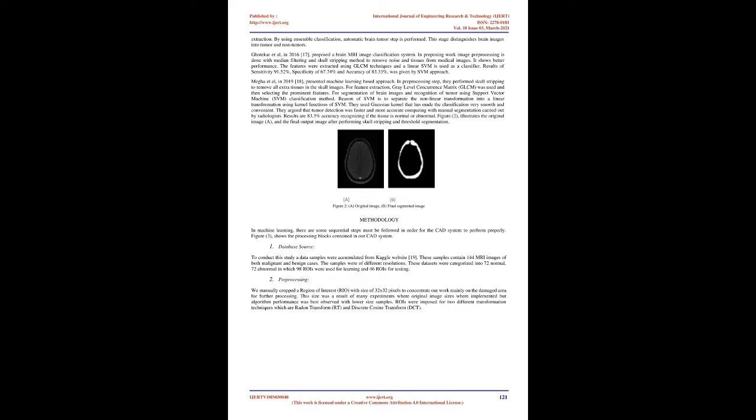A classifier, random forest, RF, is used to segment the original brain image into normal or abnormal. For severity diagnosis, the RF classifier used a weighted voting method to segment the brain images. Figure 1 shows the final result of the isolated tumor as a pixel segmented image, A, and the spot of the detected tumor of the input image, B.